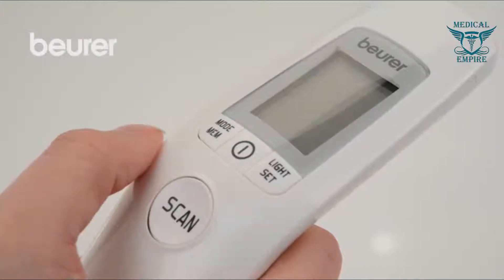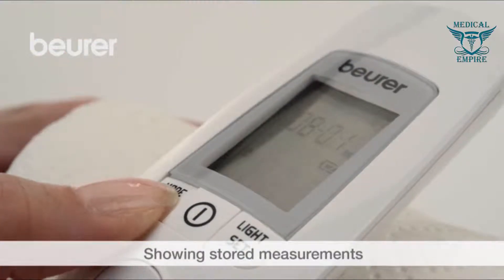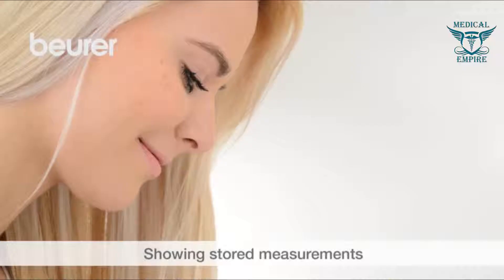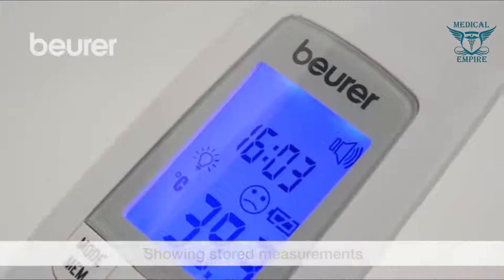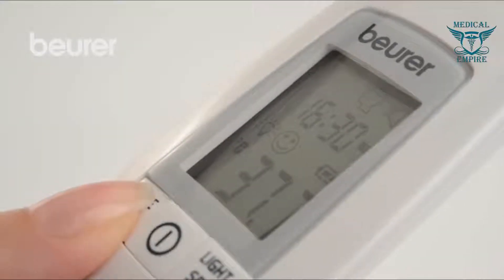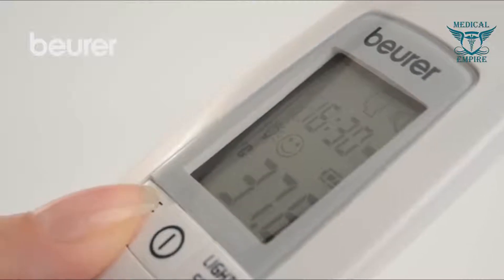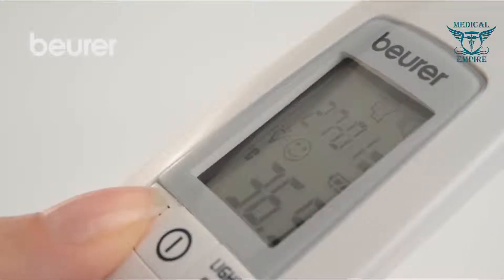Switch the device off after each use or wait until it automatically switches off. Press and hold the mode MEM button for five seconds to read out measured values. The most recent measurement is displayed. With each subsequent pressing of the mode MEM button, the storage space number is displayed first, followed by the measurement when the button is released.